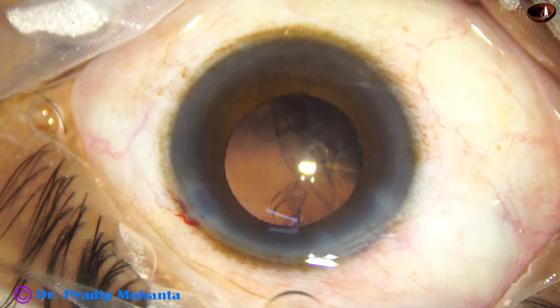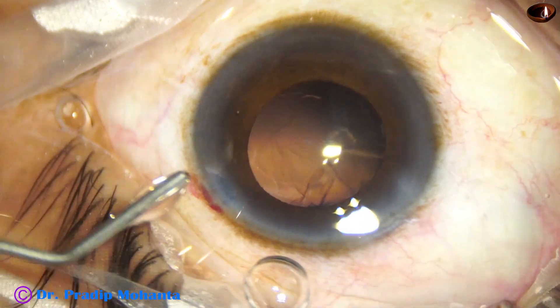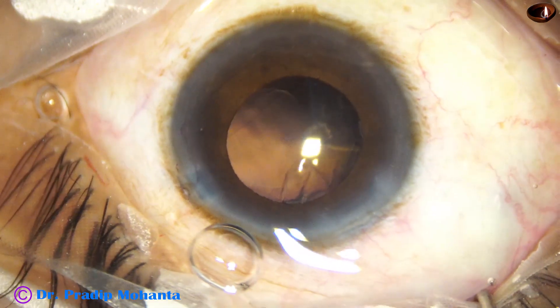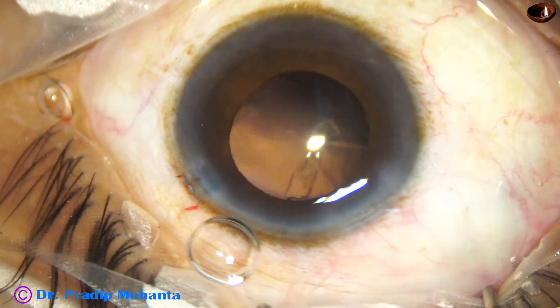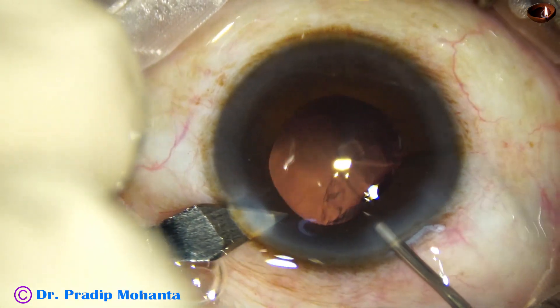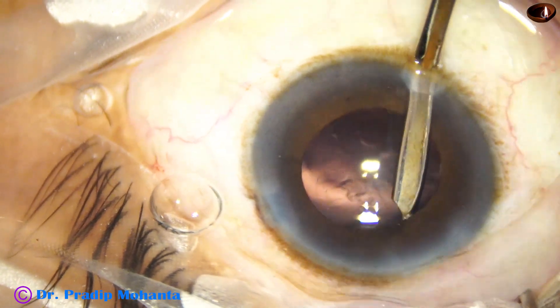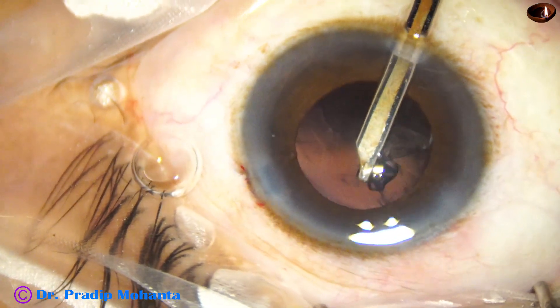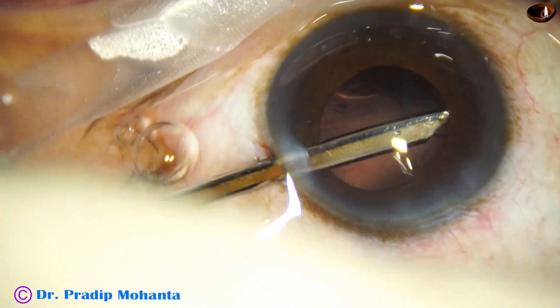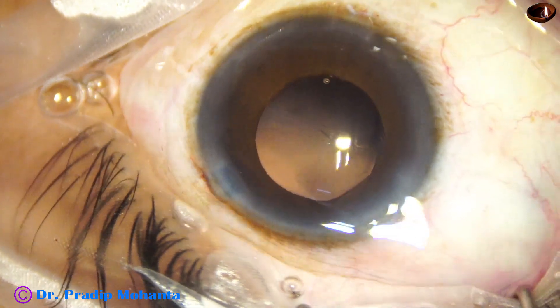The side port is small and I could not go through it, and there is some sub-incisional cortex. So I am planning to make another side port at 7 o'clock on the posterior aspect of the limbus. Some more viscoelastic, and the left side port is also enlarged a bit. Now I am going to use the 23-gauge Simcoe again to remove the cortex from 11 o'clock, 12 o'clock, and 10 o'clock — it becomes very easy to remove this cortex from a 7 o'clock side port. Then I go through the left side port and remove the cortex from 6 o'clock to 10 o'clock.